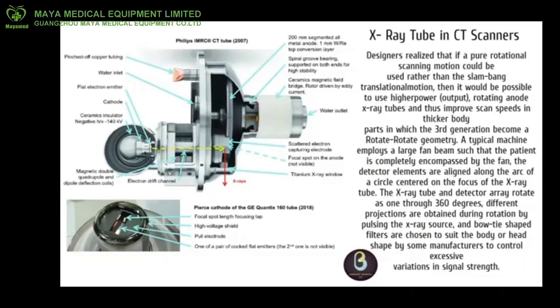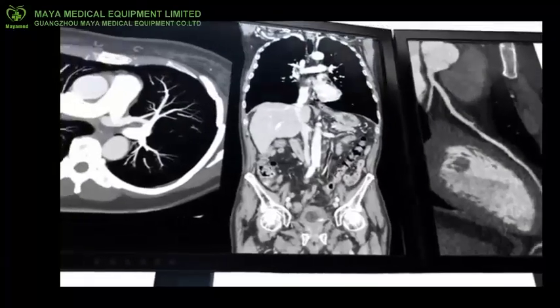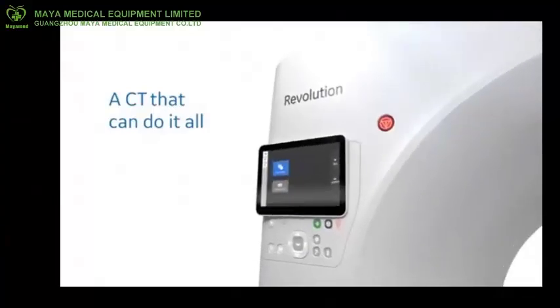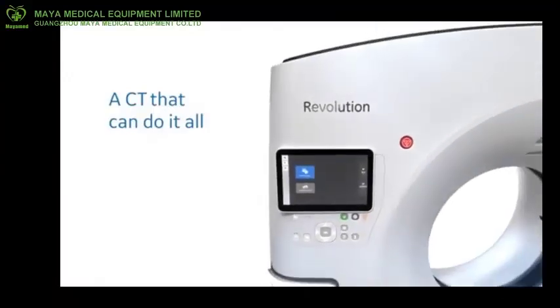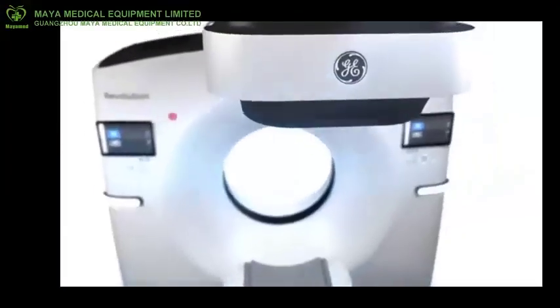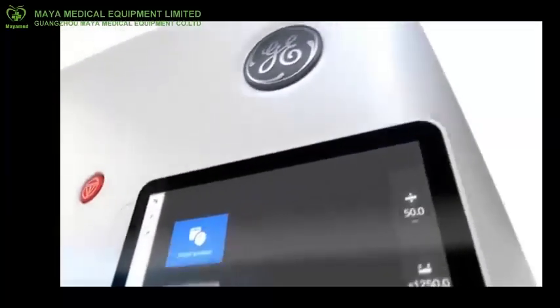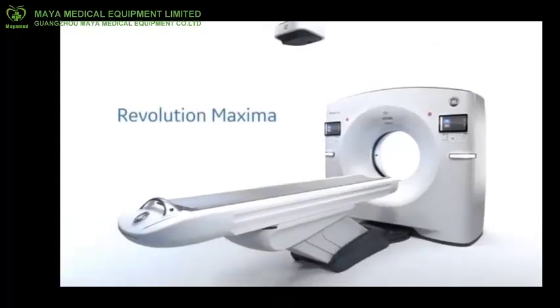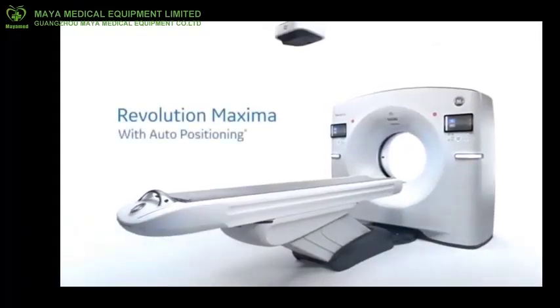Just as in standard X-ray tubes, because of reduced penumbra, small focal spot computed tomography tubes produce sharper images, like better spatial resolution, but because they concentrate heat on a smaller area of the anode, they cannot tolerate as much heat. A very large amount of stress is placed on the CT scan tube. Scanning protocols often require multiple exposures performed on numerous patients per day. A CT scan tube must be designed to handle such stress.